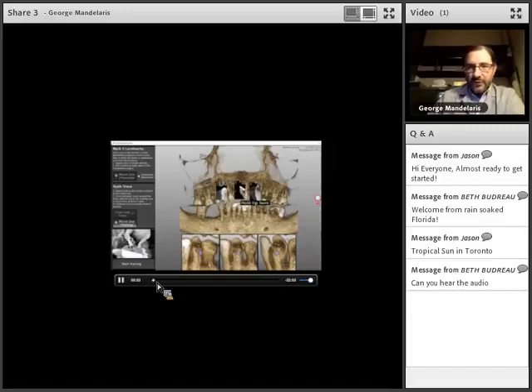And you can see where it'll say hold the tip here. So that's our first indicator. So there she is holding it. It's registered it now. The Micron Tracker has picked it up, and now she's doing contact mapping. She's basically got 6 points so far. She's going to hold that again, make sure that it registers. Once it registers, she'll finish the contact mapping. There she is holding it to the tooth. Once it registers, and now she's basically mapping out 100 points on the tooth so that it's registered.